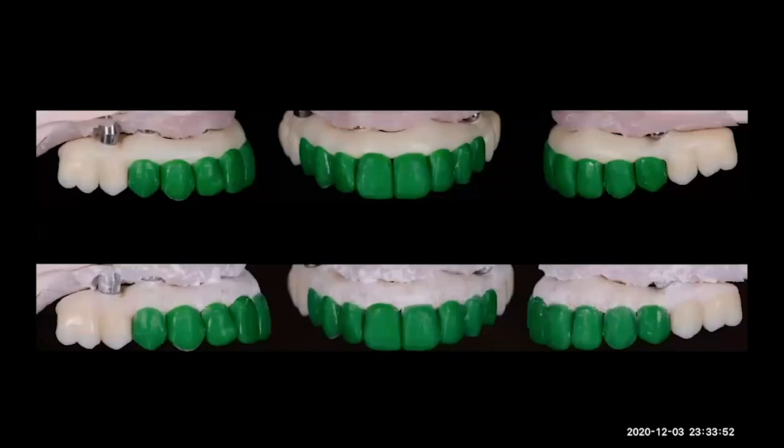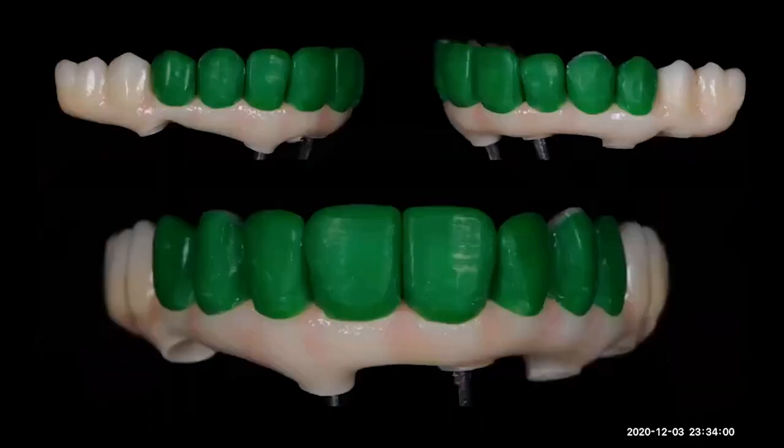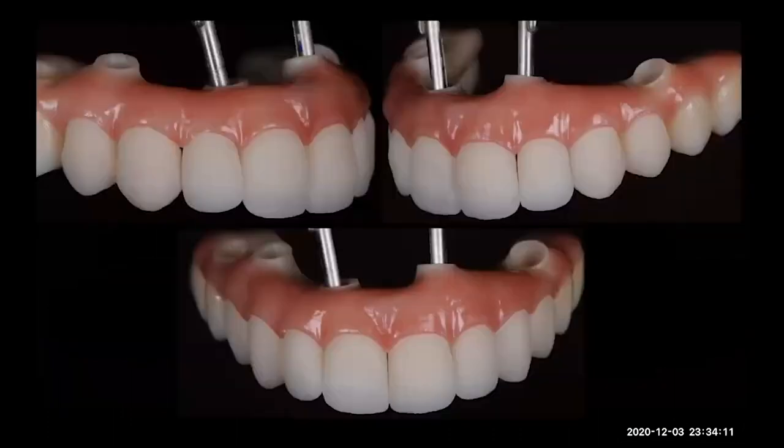Okay, so we have the frame, we have the wax, then we have the zirconia frame done. This is pre-try-in. Then we start doing our pink ceramic buildup, little by little, then we press our Emax crowns.